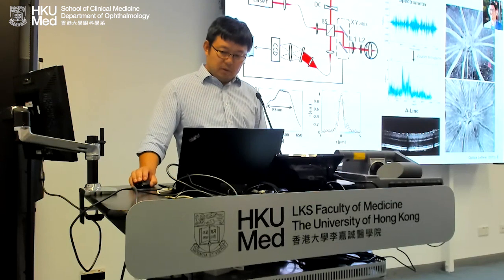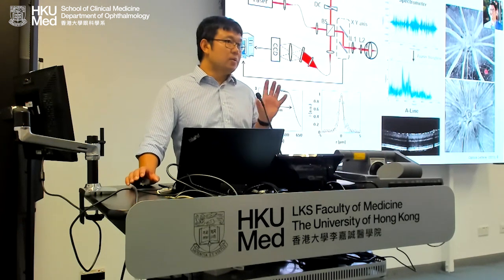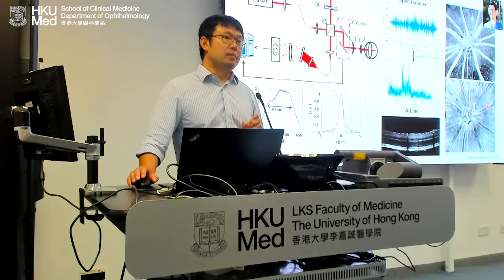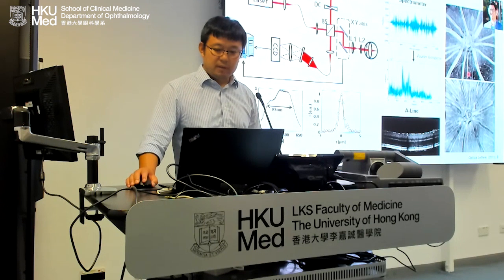And I want you to look at these small bright signals. These are actually capillaries without doing any angiogram at the time. In 2013, angiography wasn't even commercially available. We can visualize that. So that's the high contrast benefit.